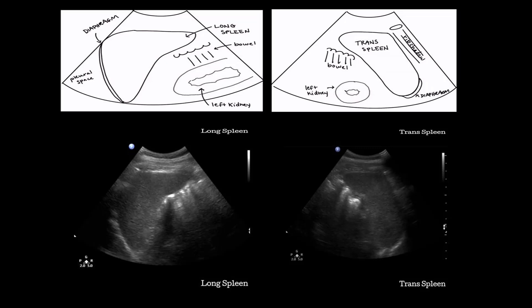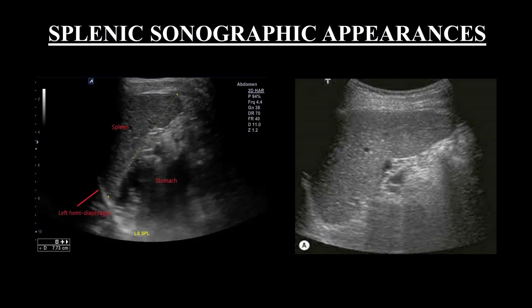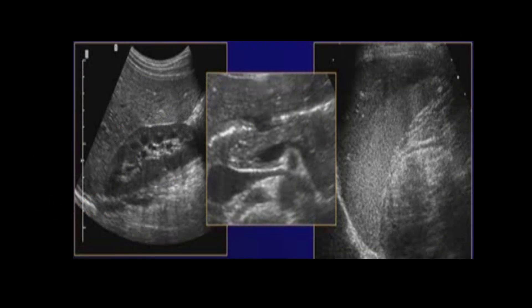In the transverse section, rib shadowing can appear in certain areas, along with part of the bowel loop, and the left kidney at this area. The spleen's sonographic appearance is homogeneous, moderately echogenic, with less visible vessels than the liver. The spleen echogenicity is slightly more than the liver, and it could be equal to or less than the pancreas, and more echogenic than the renal cortex.